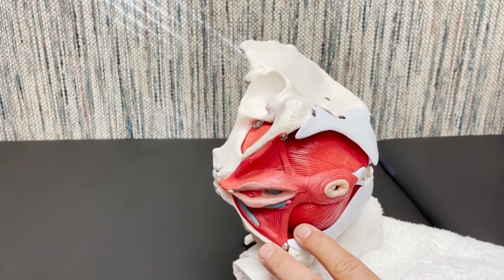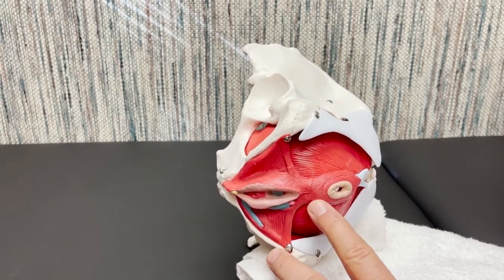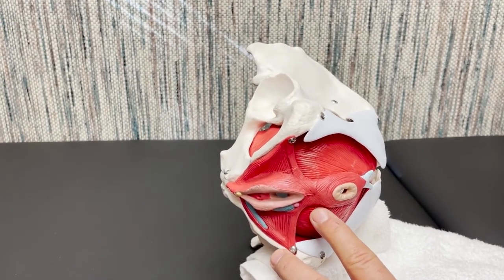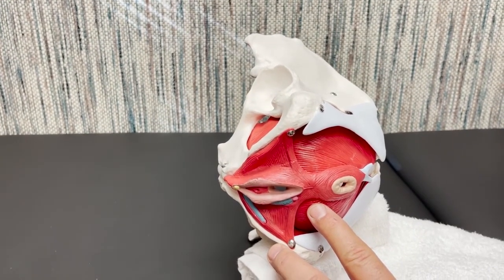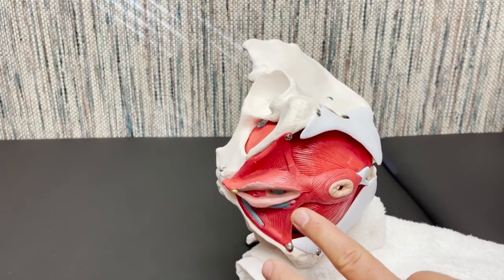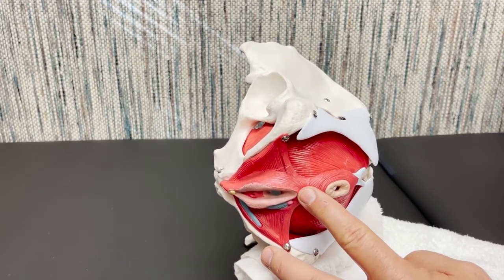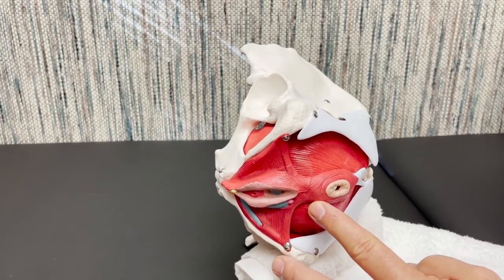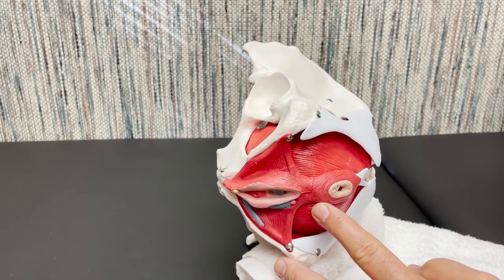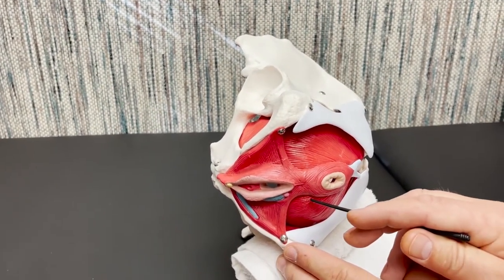And then 1 finger breadth lateral from the midpoint between the perineal body and the anal sphincter, we're going to needle 45 degrees both cranially and anteriorly relative to the treatment table.